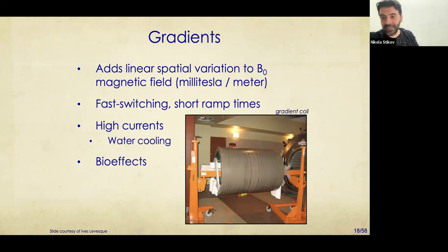But all of these things are actually very tolerable, and they do not prevent us from actually using the MRI scanners. They're known side effects, but so far nobody's died from them. And that's why for about 50 years, MRI has been used, very safe.